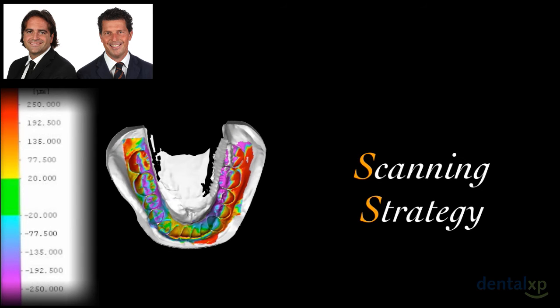And as I was telling you, we are still working on this, in the sense that it's still early for somebody that just bought the intraoral scanner to go for this kind of restoration, because especially for this kind of complex rehabilitation, you have to have a scanning strategy. For example, look at this picture on the left side. In this full arch rehabilitation, you can have an error of 250 microns, but there are protocols that are helping you to avoid this kind of error.